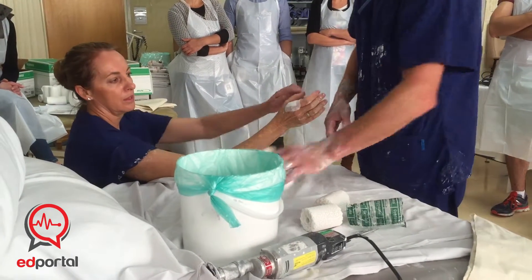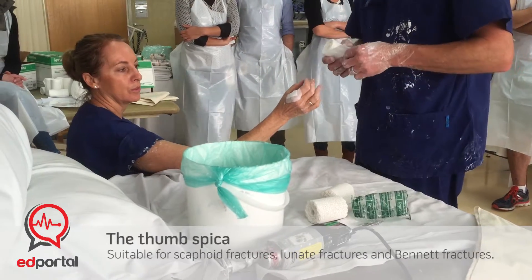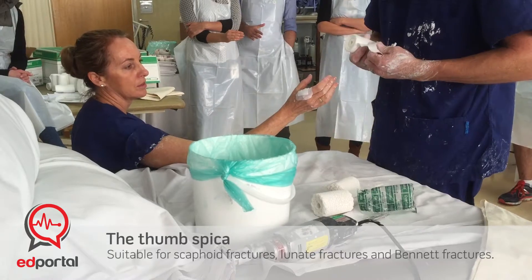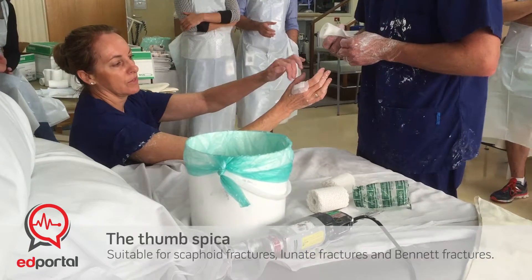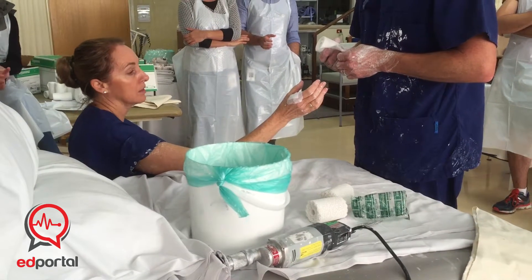Wrists slightly extended backwards and the thumb pretty much in a straight line, but we want the fingers to be functional so we want them to be able to grip. So if you tell them to make sort of a C-shape, or imagine they've got a can in their hand — that's what we normally say to them as a guide as to how we want it.